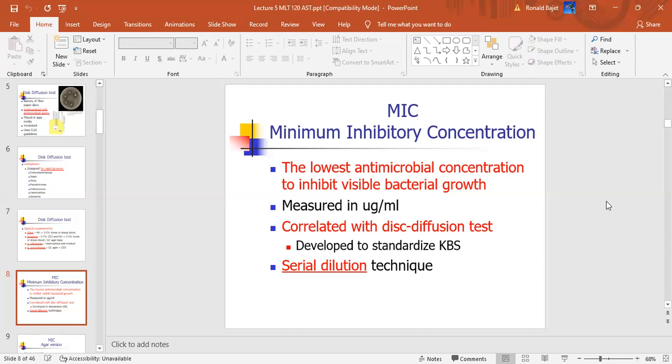Okay. So let's say these are the concentrations of the antibiotic. So the antibiotic is diluted twofold across 9 tubes, right? Which tube has the highest concentration of antibiotic? The first one. So here, this has the highest concentration of antibiotic, and this one has the lowest.